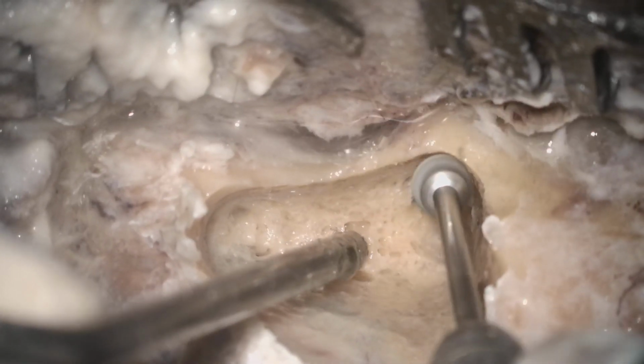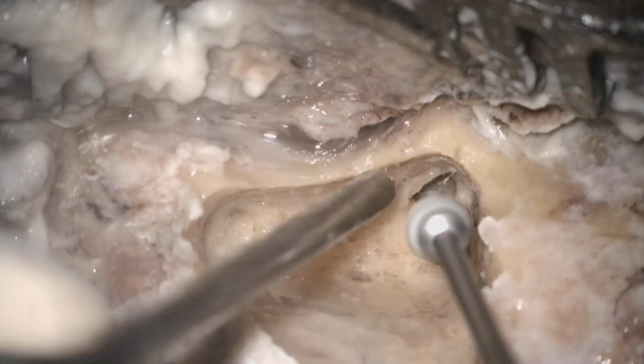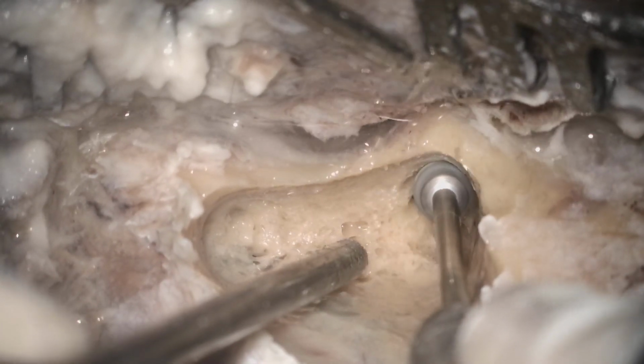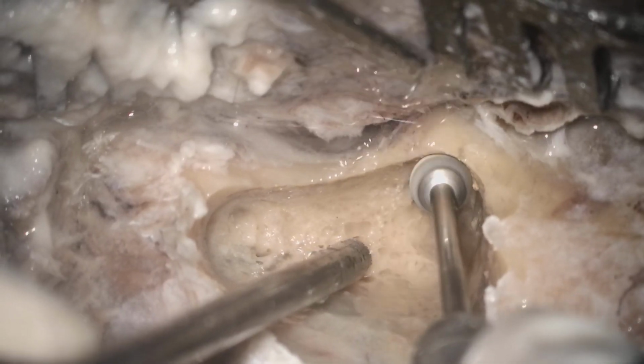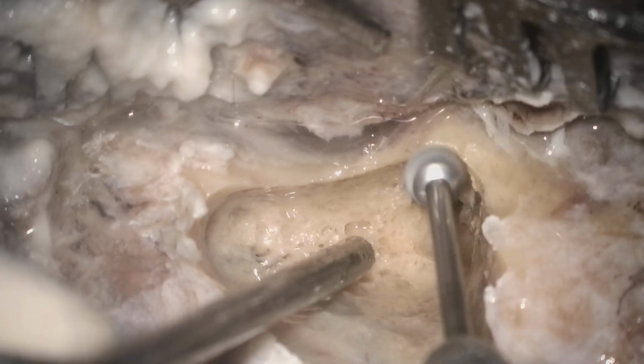It will not hit any important landmark medially, because all the landmarks are in the medial part. So you start in the medial part and come slowly to the lateral direction like that. Give water continuously. Okay, like that.